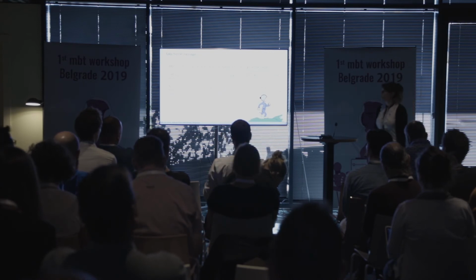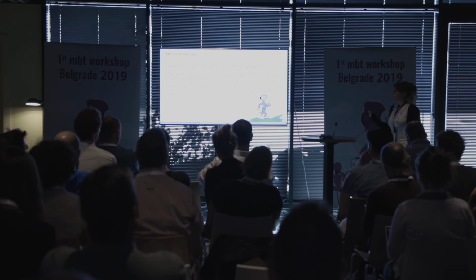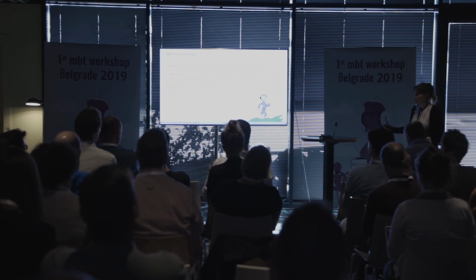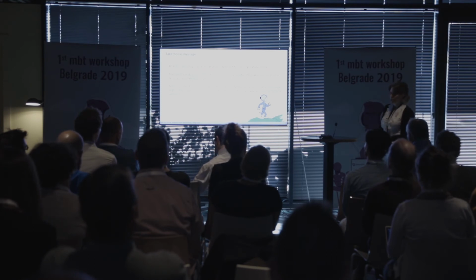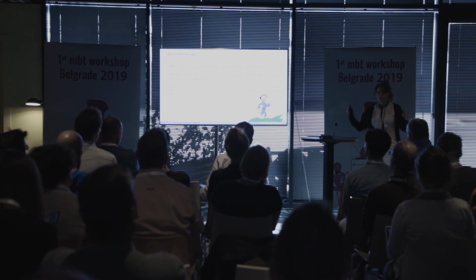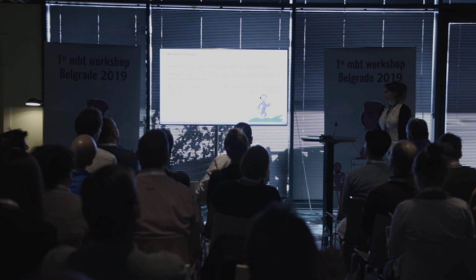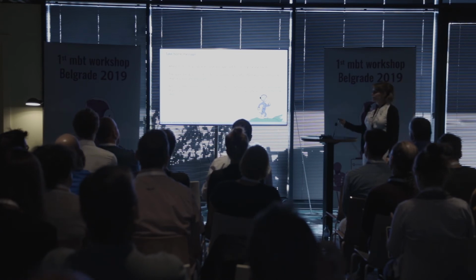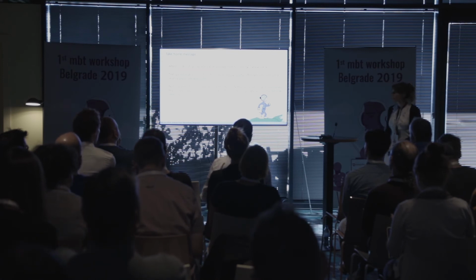So, okay, I will just conclude. Attention decoding is actually a complementary approach to the ERP analysis for the running scene, basically. You take the entire stimulus and the entire EEG signal, and you relate them to each other. This is very convenient for mobile EEG, I believe.